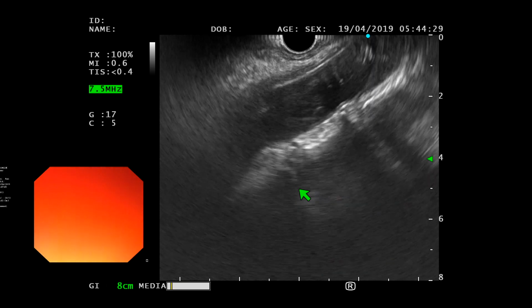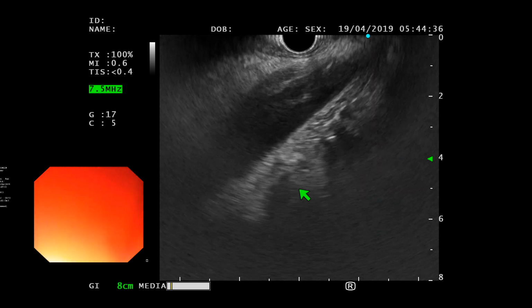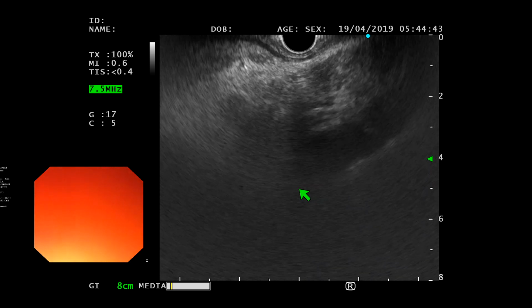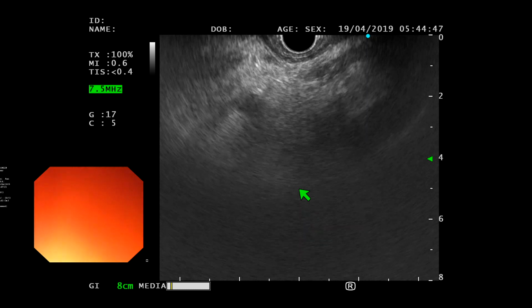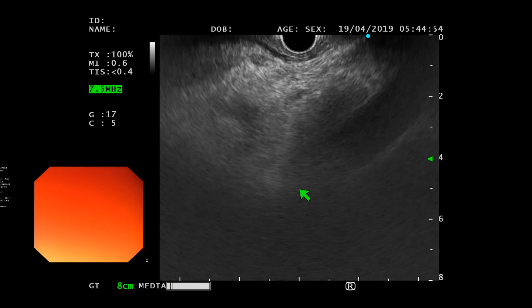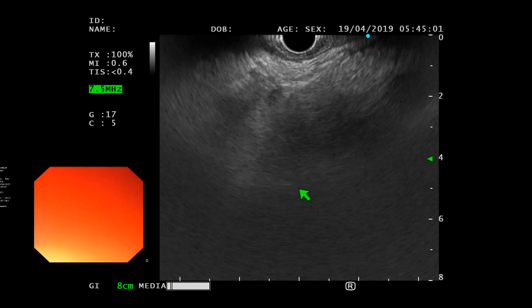What a beautiful landing this is. Yes, you can see the difference you've made to it. Diaphragm, celiac. Beautiful. Very nice. SMA. Thank you. Push a little more, 2 centimeters, and relax the scope. It has a very small frame, don't expect that I need such a big one. You know that she is not. No, it's okay. Beautiful. So you found the SMA straight away, didn't you?